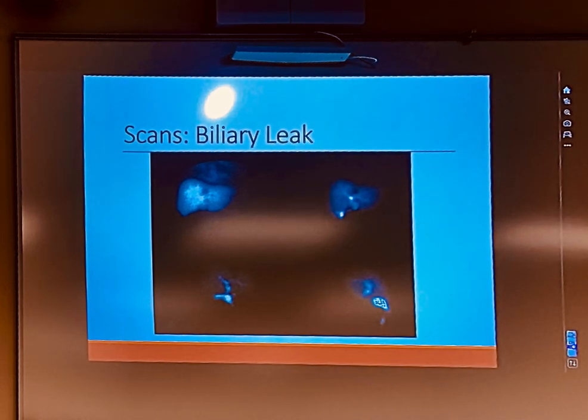Because if I just saw that image on a test, I wouldn't know unless somebody told me that. Well, here's the thing. You see a study that looks like this, that's when you lean over to the patient and go, are you sure you didn't have your gallbladder out? Then you flip to the chart and start looking. Sometimes patients don't remember, like if they're older and they had their gallbladder out when they were 30 and they're 70. But these biliary leak studies will come off rule out leak. You're gonna know when the patient comes down.